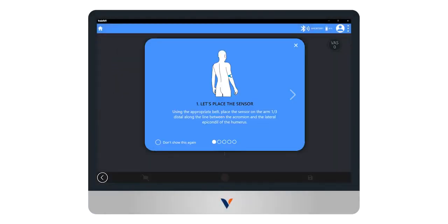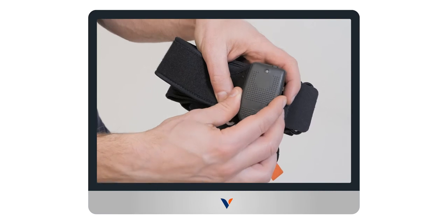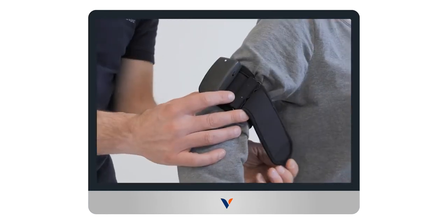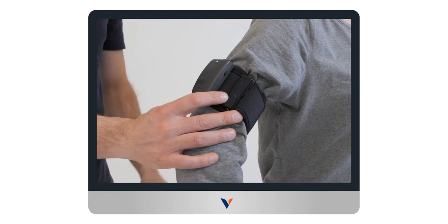As shown by the pop-up, to obtain reliable and repeatable data during the execution of the test, it is necessary to correctly position the sensor on the subject to be evaluated. For the shoulder test, the sensor must be attached to the appropriate belt and positioned laterally on the arm and distantly 1/3 along the line that joins the acromion to the lateral epicondyle of the humerus.